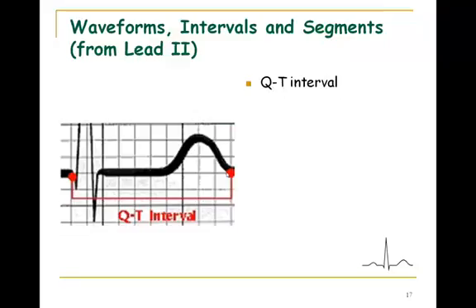The length of it will vary depending upon something like your heart rate. The QT interval, though, may also be shortened in something like hypercalcemia. It can be longer in hypocalcemia. There are other things that may affect the QT interval, but it's beyond our scope.